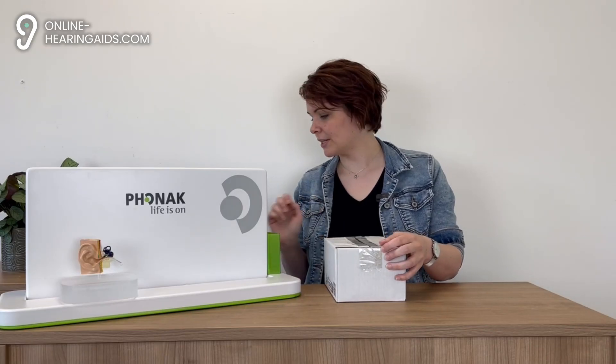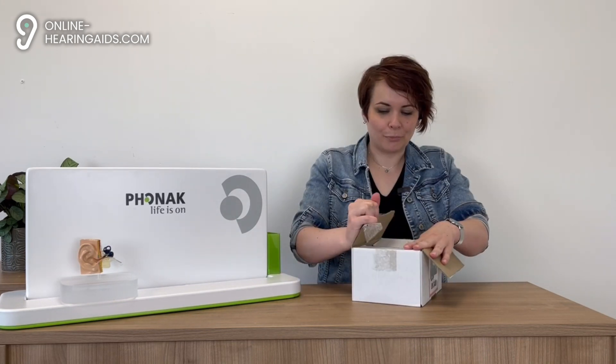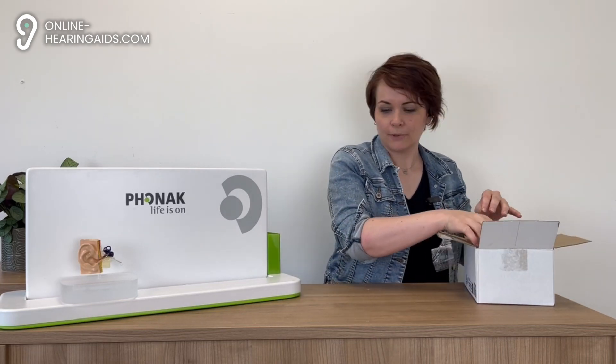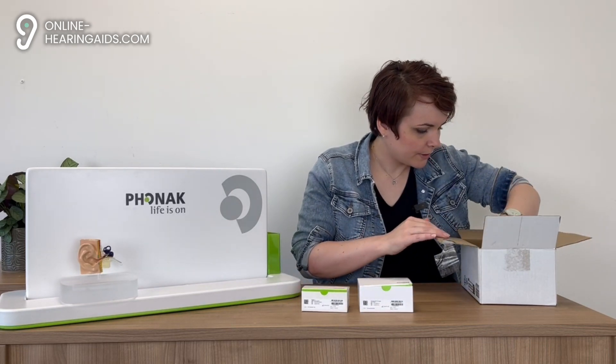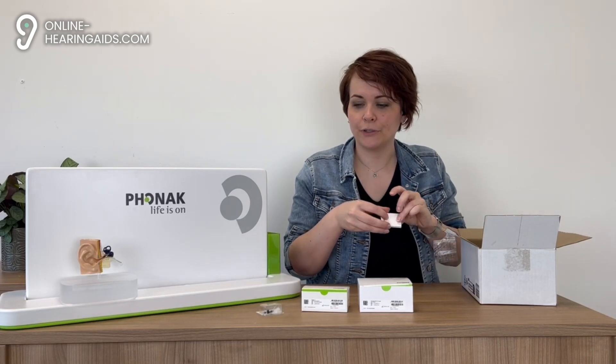We have two products here, brand new as you can see. This is the first one and the second one. They also come with their receivers as we all know, and the Siri Stop filters.